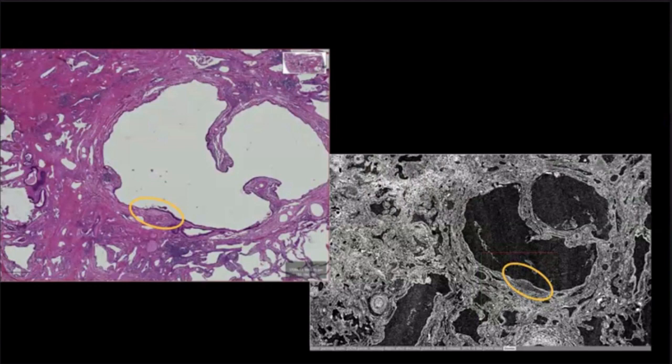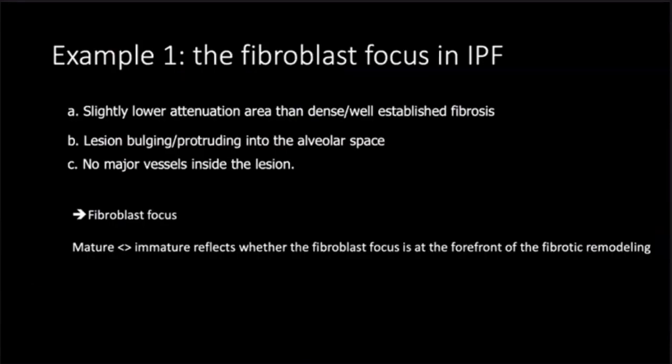But actually, when you look in more detail here at the HiP-CT scan, you can see the same structure being present here. And you can see that it differs from the microenvironment. So its density has decreased. The attenuation has decreased. And you can actually nicely discriminate this. And this was for us the golden proof, the proof of the pudding, that we can safely and reliably identify the structure. And when we can identify it, we can also quantify it in more detail.